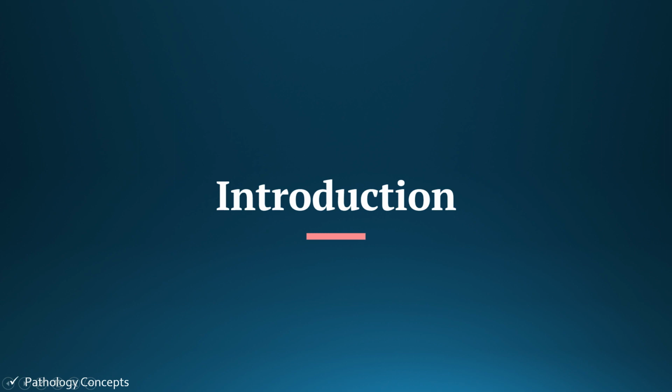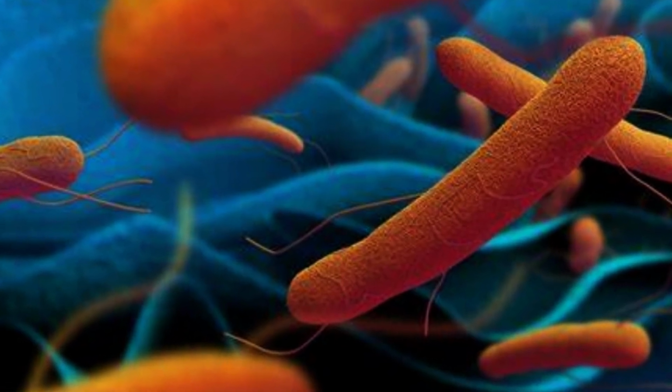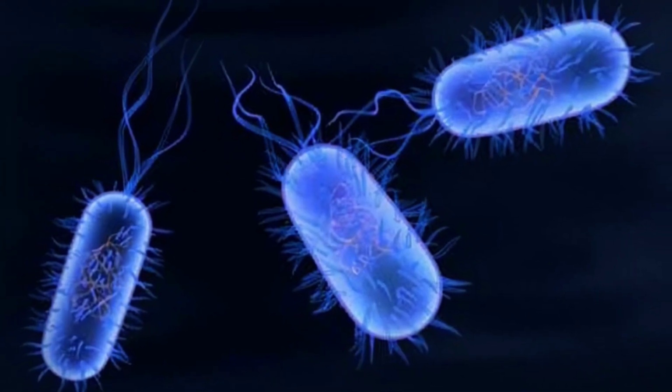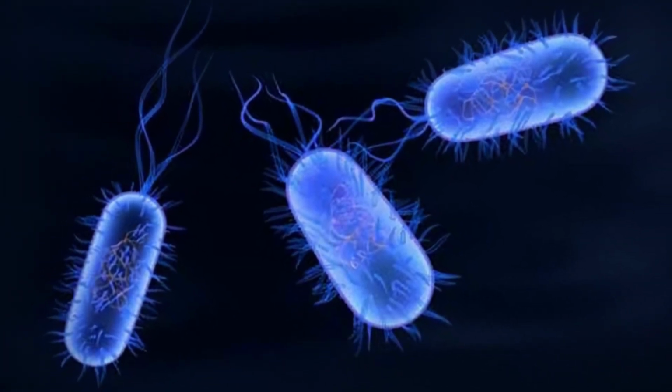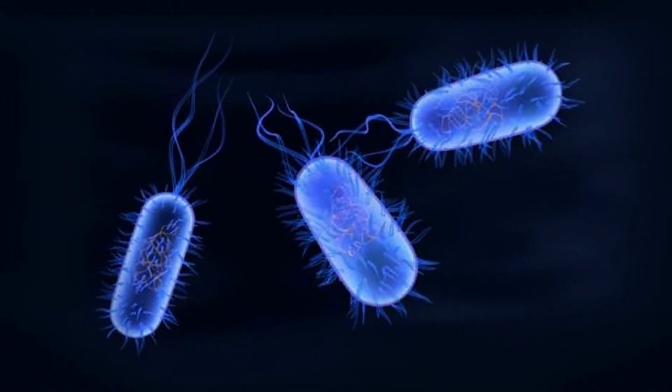Introduction. The Widal test is used to detect typhoid fever and paratyphoid fever. Typhoid fever is caused by the Salmonella enterica serotype Typhi, and the paratyphoid fever is caused by the Salmonella enterica serotypes Paratyphi A, Paratyphi B, and Paratyphi C.